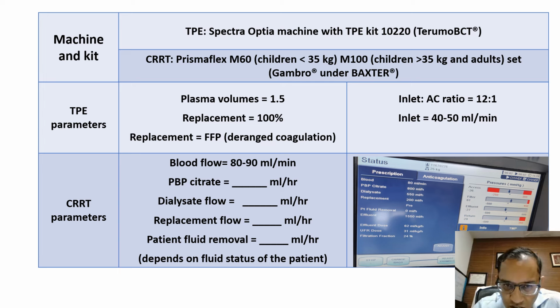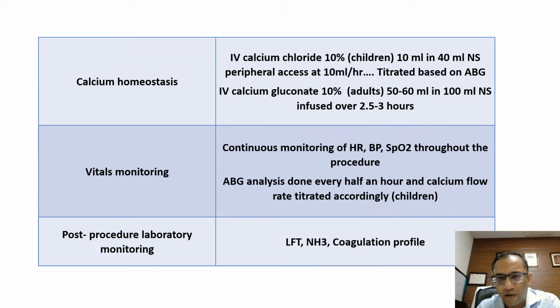So the blood flow remains the same, only you have to redistribute it. Because centrifugation plasma exchange therapy works at a very, very low rate, in one pediatric patient we reduced it to 20 ml per minute because the patient was not tolerating it well, and we reduced the blood flow in the CRRT to around 60 ml. So the total combined was 80 ml per minute.